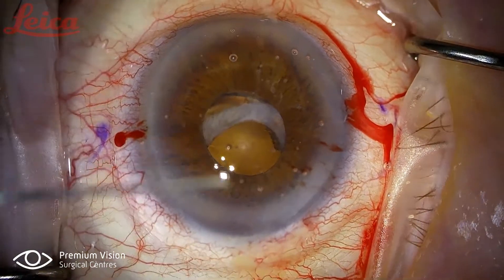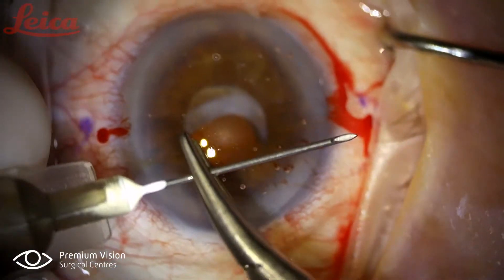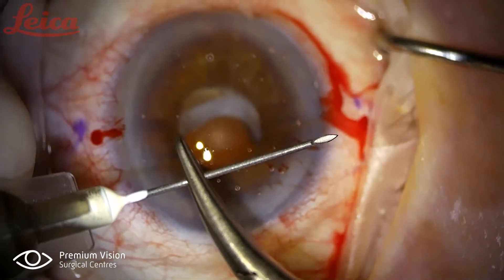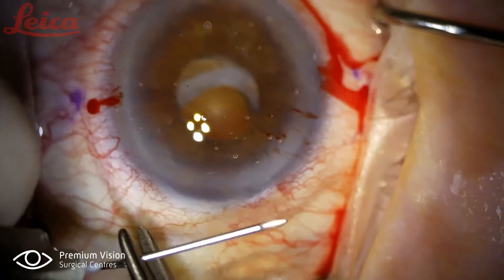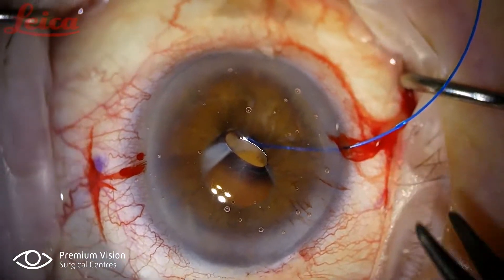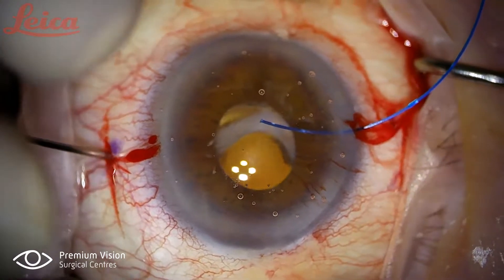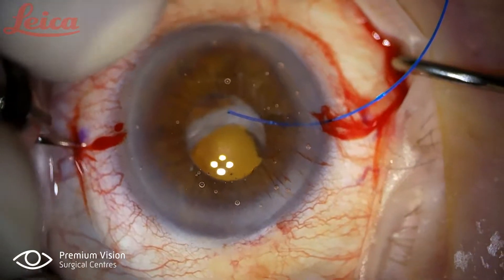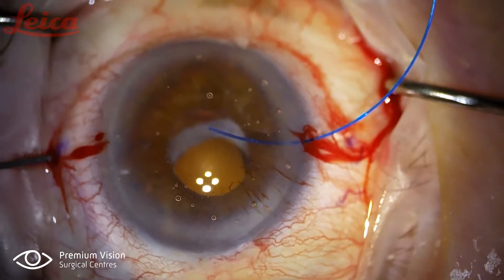Hi, I'm Dr. Youssef. I'm presenting this case of a traumatic dislocation of an intraocular lens and capsule tension ring implanted in a patient with pseudoexfoliation syndrome in 2012. In pseudoexfoliation syndrome I usually don't implant capsule tension rings, but in this case I did because it was a very advanced amount — and I'm glad I did because I'm using it now to suture the lens.